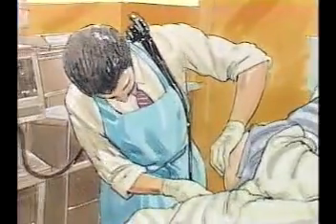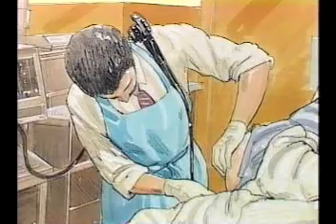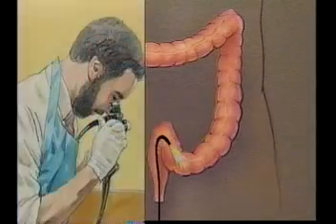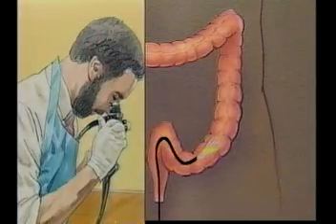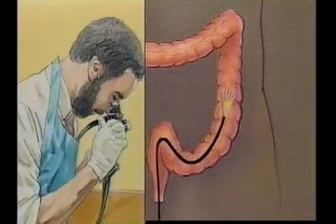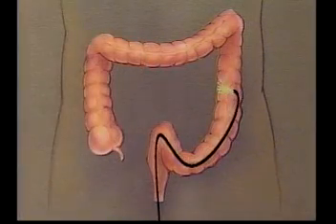The doctor will slowly and gently insert the lubricated end of the colonoscope through the anal opening into the lower part of the large intestine. The tube is then advanced slowly through the anus and into the colon. The controls on the colonoscope permit the tube to be steered so that when each turn or loop is encountered, the tip of the scope can be maneuvered through it.